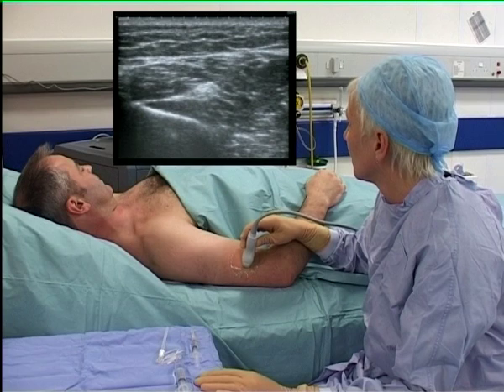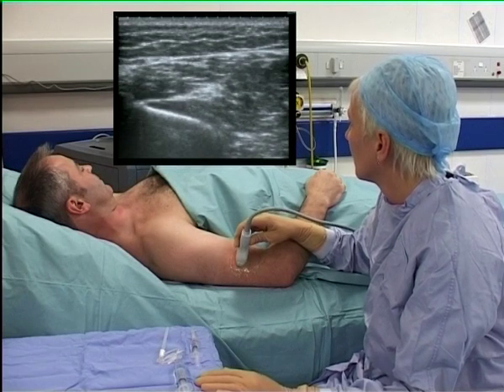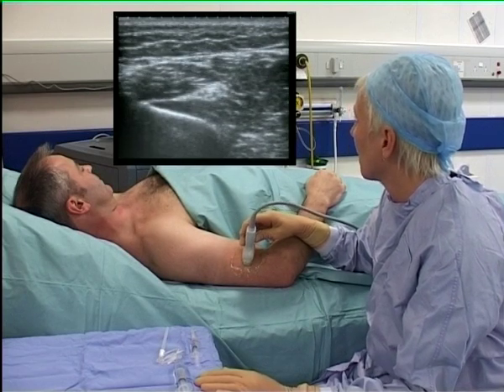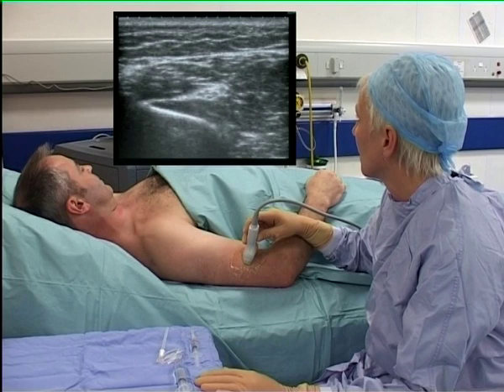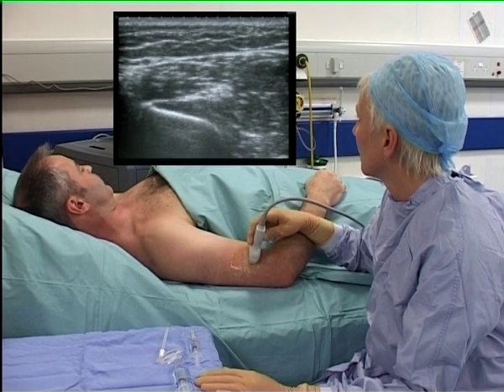The nerve can be blocked at any level here, but the injection is perhaps most comfortable where the nerve is not too close to the periosteum of the humerus.